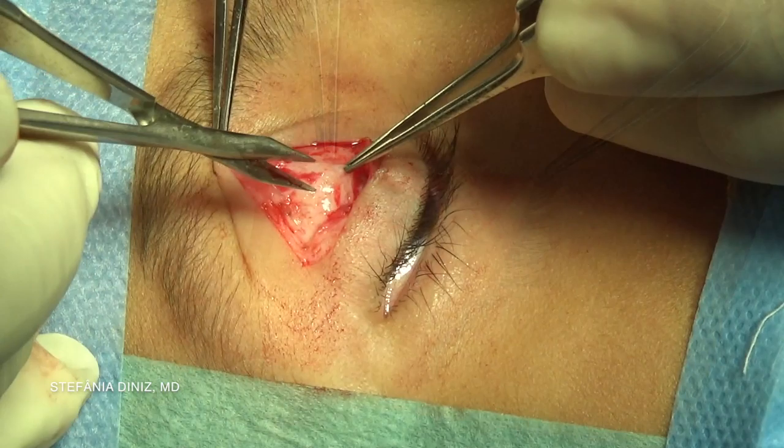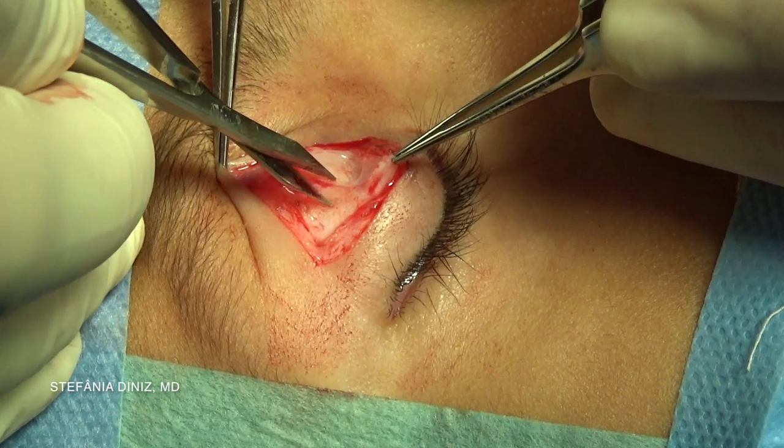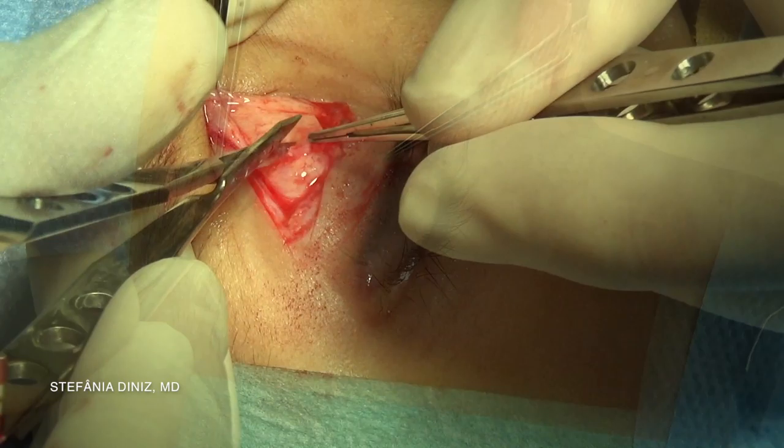Dissection is carried out through the septum in order to identify the preaponeurotic fat. You can notice a thick septum, usually found in children. Palpation on the globe can guide your dissection.